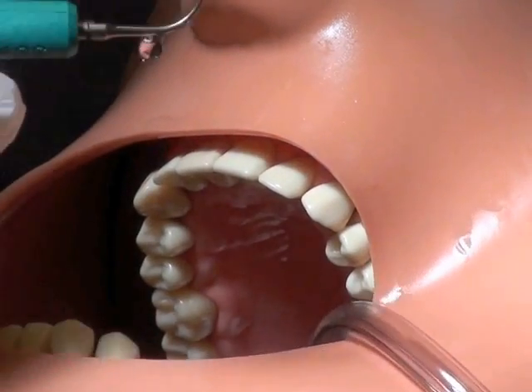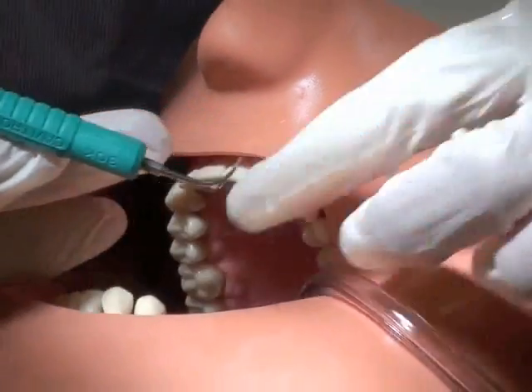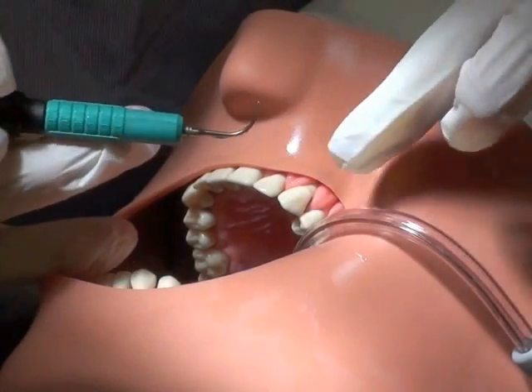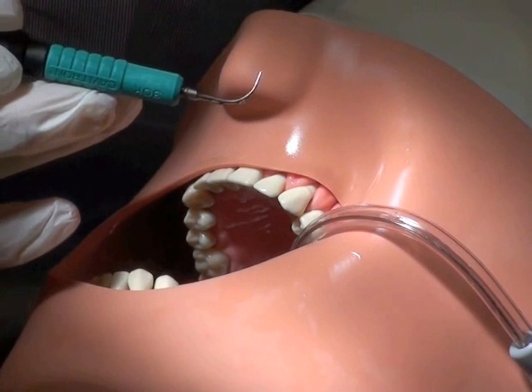Things to keep in mind: keep the tip in constant motion. Always use the side of the tip — the last few millimeters — and make sure your water flow is adequate.